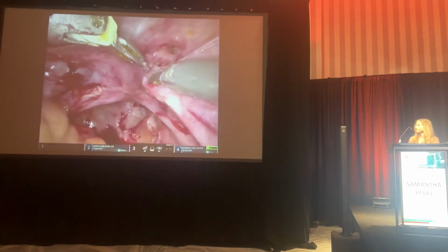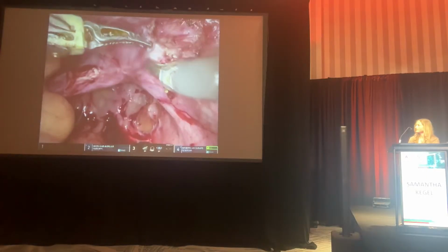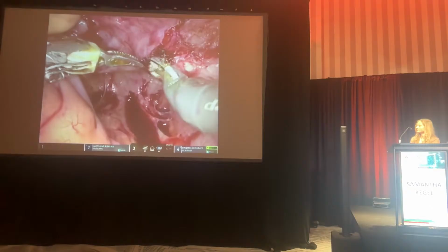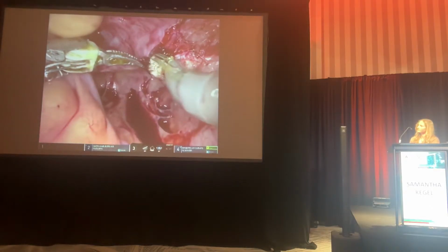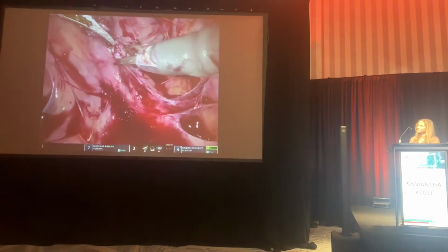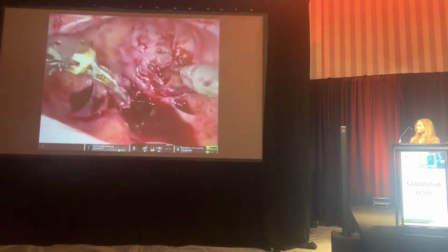The endometriosis implants on the pelvic peritoneum were removed using a combination of blunt dissection and the monopolar scissors. Wide excisions were performed, particularly at the deep lesion on the right of the vaginal cuff and the posterior cul-de-sac, to ensure that all deep endometriotic implants were removed.